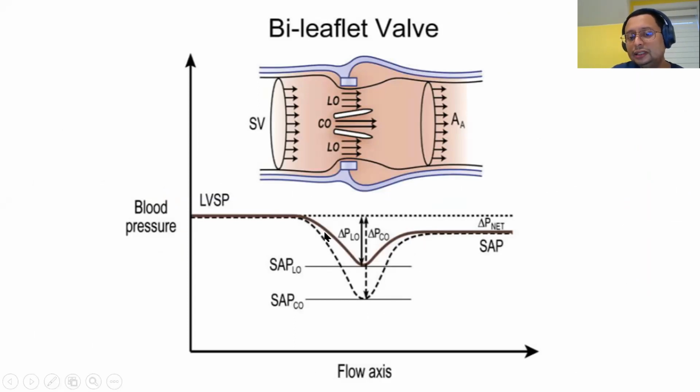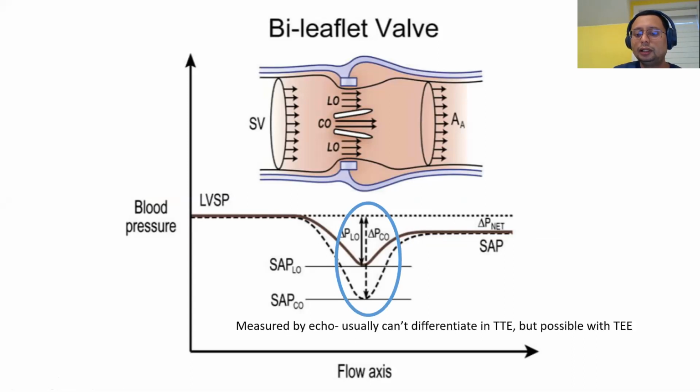However, distally, you can see the lateral orifice have now merged with the minor orifice, and the catheter will measure here. So that is what echo measures. This is what catheter measures. All right. So that is pressure recovery.